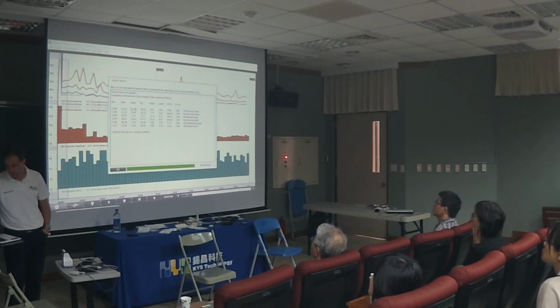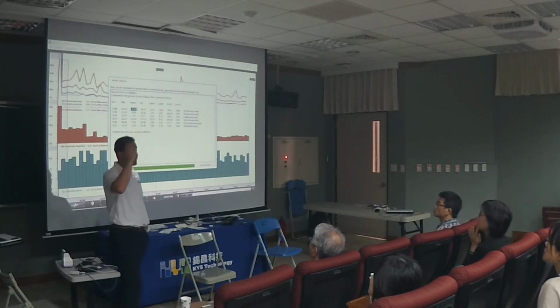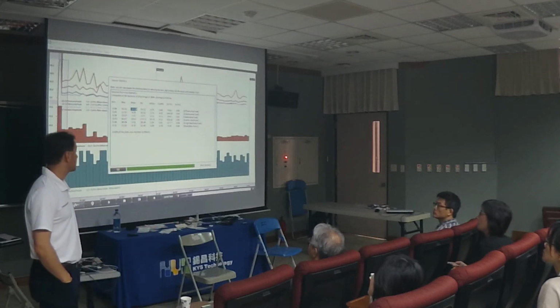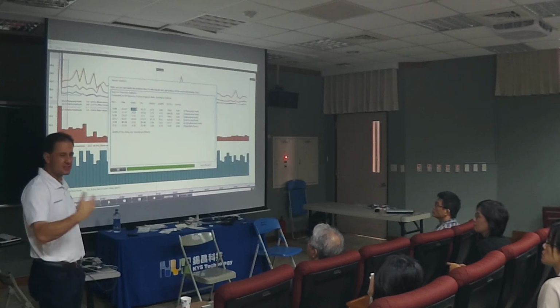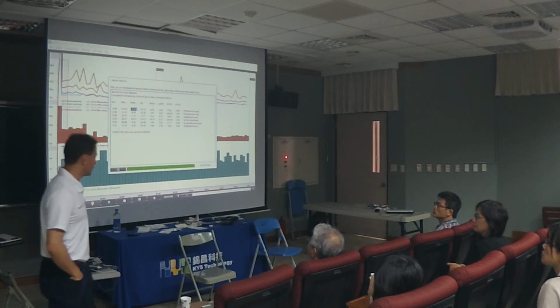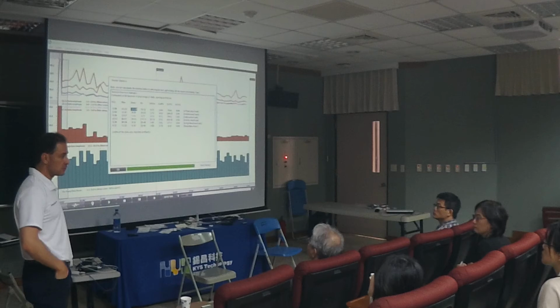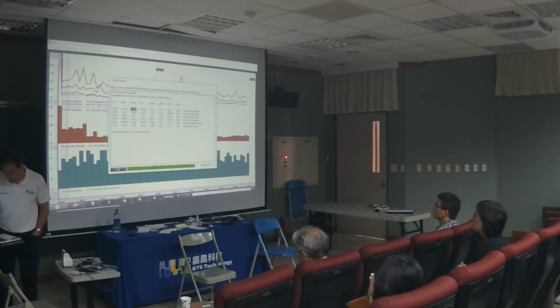So with the theta being at 13, let's set it a little higher. So at the beginning of the session, it's easier. Don't set it at 13, especially at the beginning of the training, because it's going to be very frustrating for the client. All right? So you can set up at, we could say 16, 20, so 3 microvolts above, it's good enough, right? And so what you can do is do that setup.